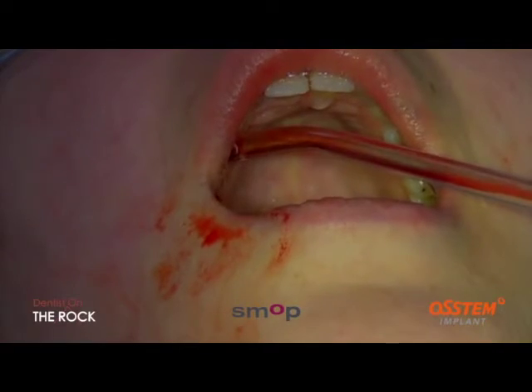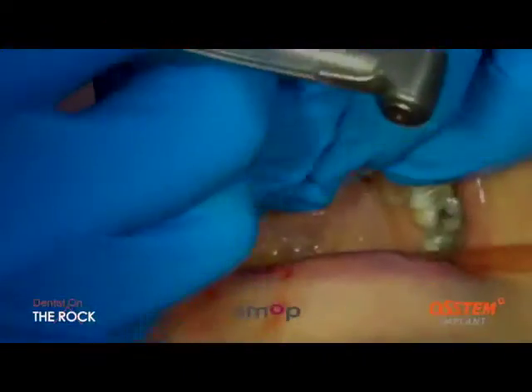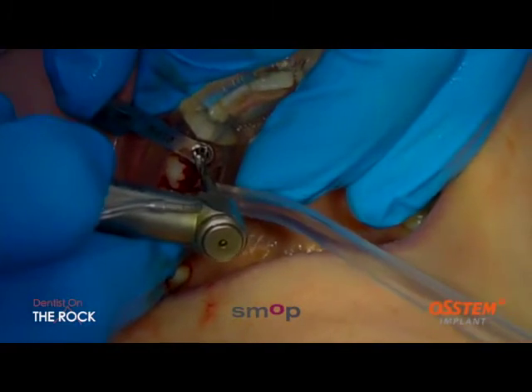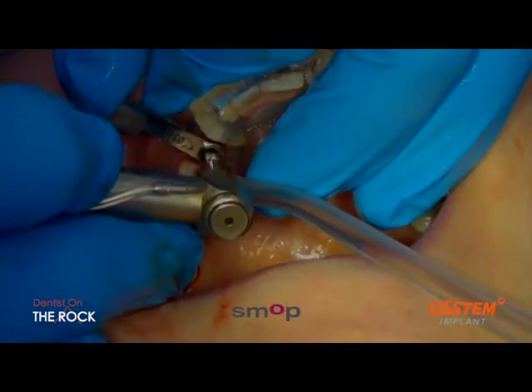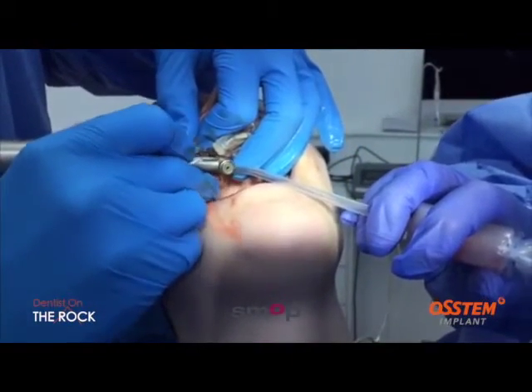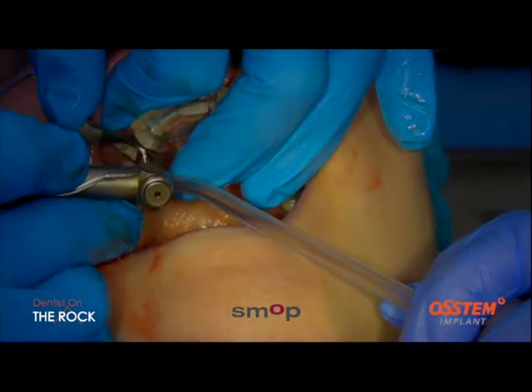So the next step, I'm going to widen it out now. So we're prepared to the full length, the 11.5mm. The next key is a little bit wider. Again, we slot that in. Feel a little bit of vibration again as this goes through. And again, pumping through. Take it a little bit deeper. Let the water cool it. A little bit deeper. Let the water cool it until the drill stop reaches the end. And then I'll let it cool a little bit more again.